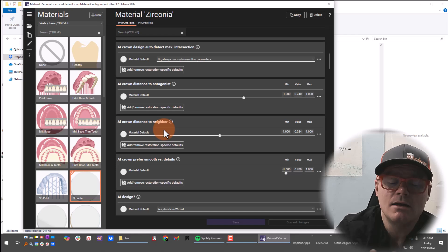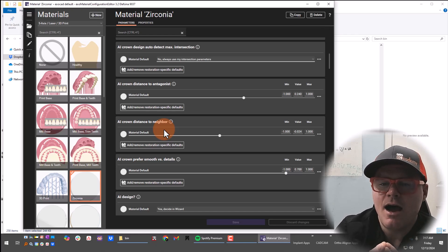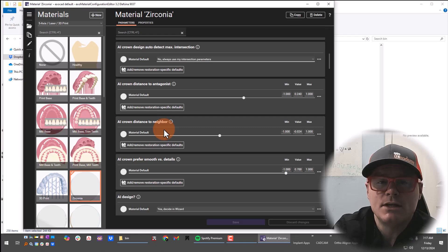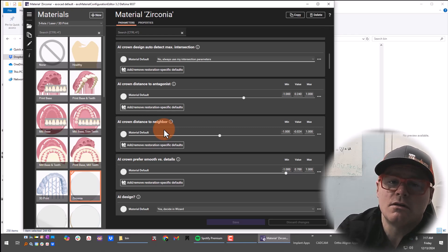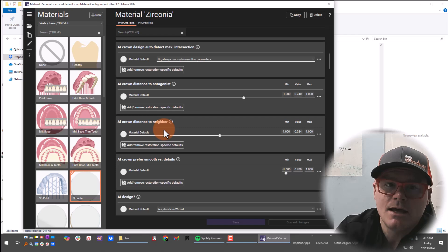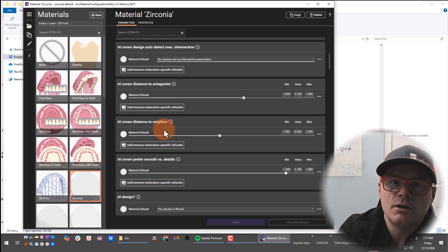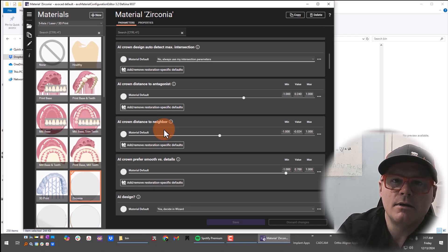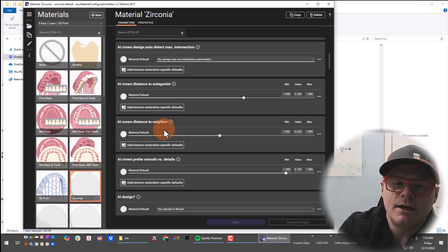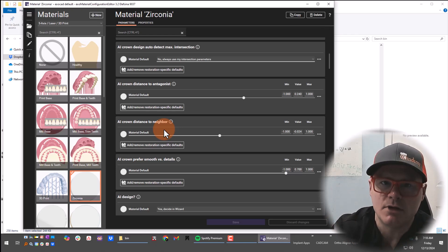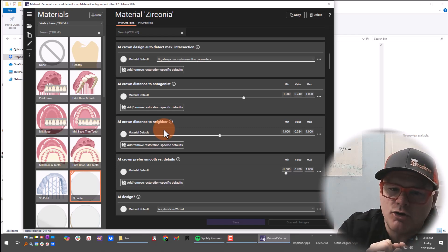That is also the reason why when I design implant crowns, I make sure that proximal value is not negative 0.24. I make sure my value for implant crowns is actually 0, because there is no give on an implant abutment — it doesn't move at all. The neighboring teeth will move, but the implant won't. So if I forget to change that value, I'm going to be adjusting those proximal contacts for a long time to get that crown to seat all the way.